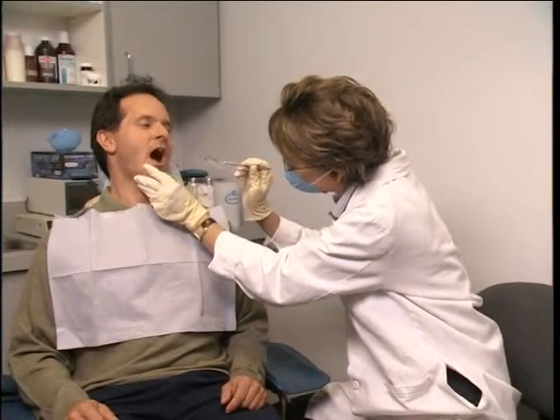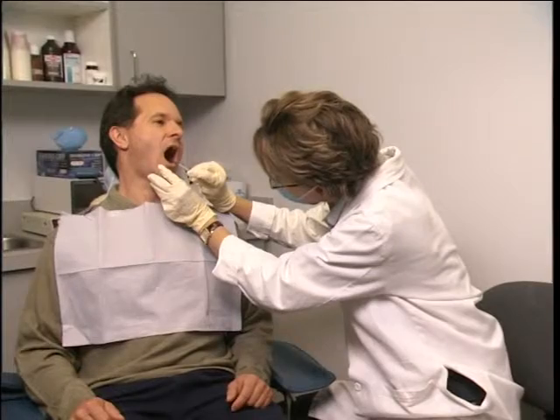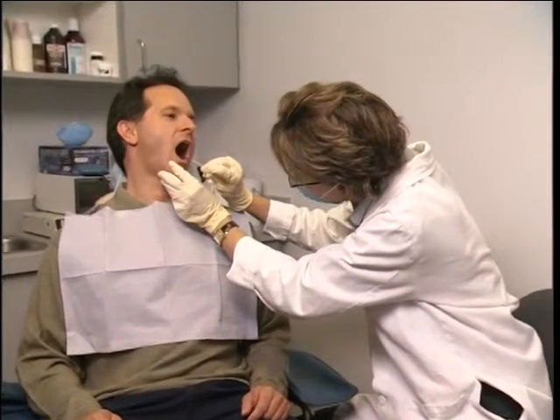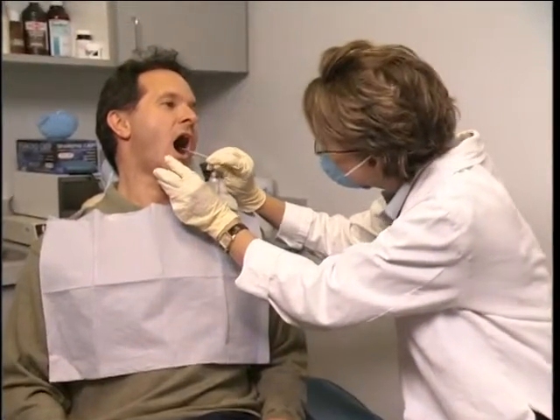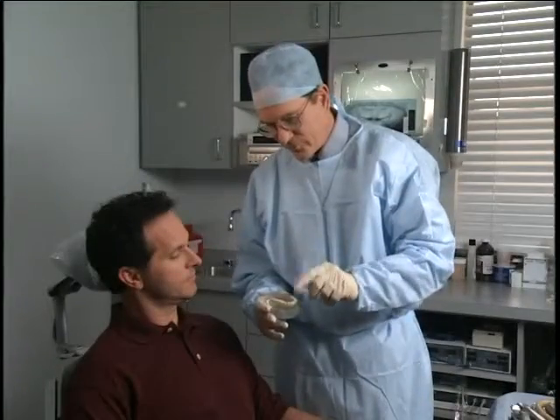When the tissues around the final posts have healed and are in good condition, the patient's dentist takes impressions of the area and begins to construct the dental appliance to attach to the posts. This finished denture or bridge may take a number of weeks or months to complete, since it must be precisely fitted to the dental implants. If chewing forces on the appliance place abnormal stress on the implants, they may fail.